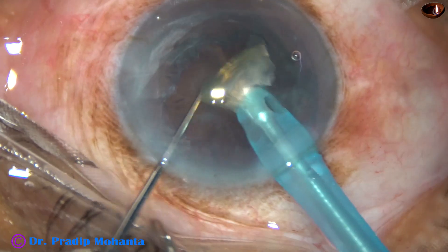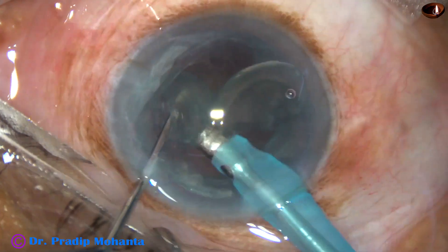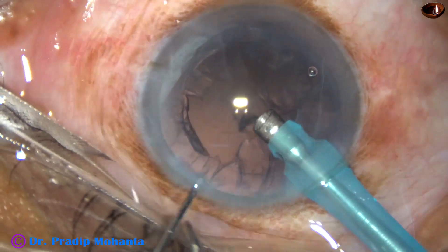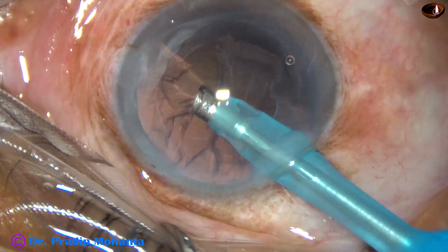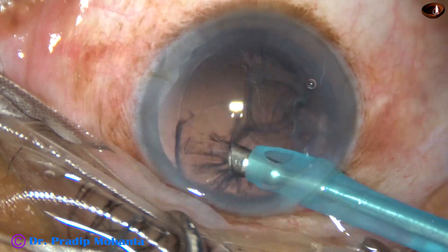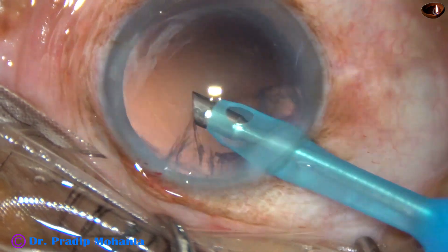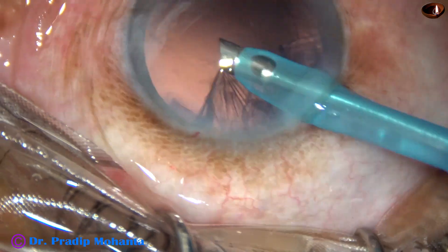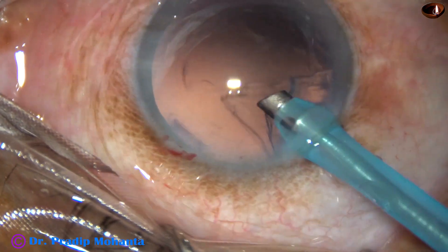Phaco power used in this case is 50%. Flow rate is 45 ml per minute and vacuum is 450 mmHg. Now some amount of cortical lens matter is being aspirated by the phaco needle itself in IA mode — about 70% or more of the cortical matter has come out.